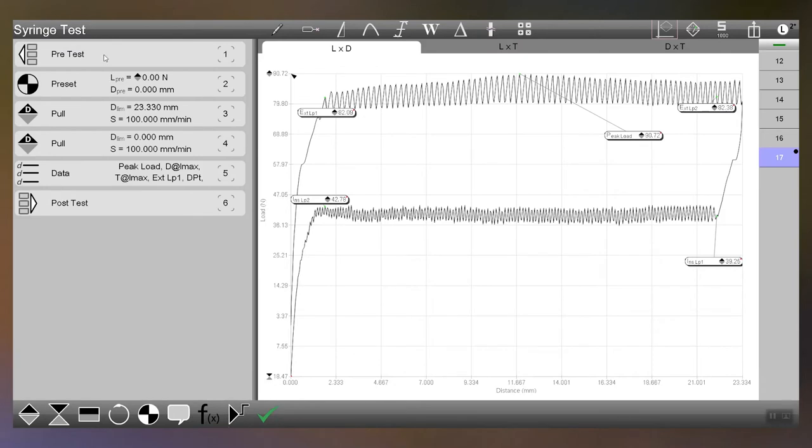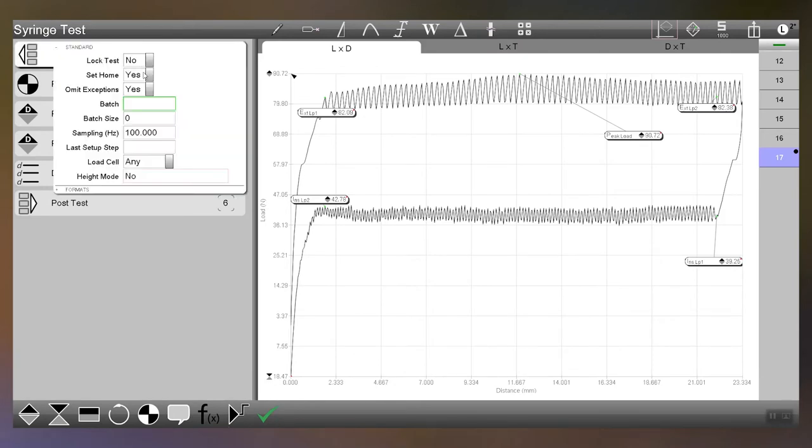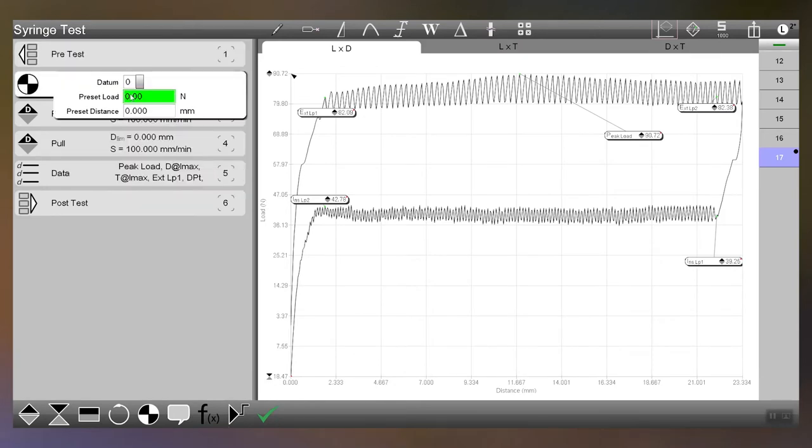So starting at the top, the pre-test pretty much all I did was set the home position. The datum I zeroed both my load and my distance. We're going to be using newtons and millimeters in this test.